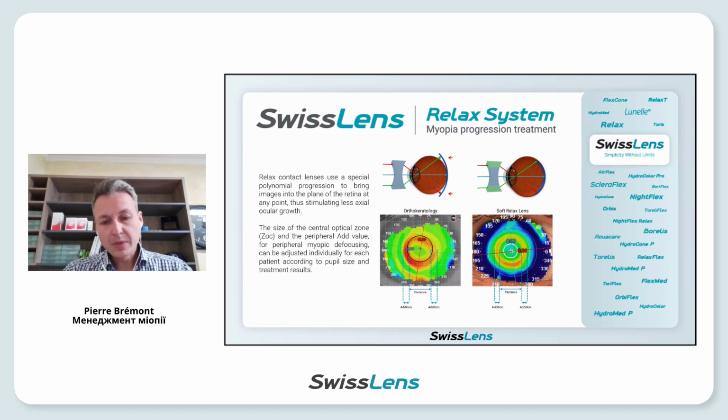So there are two main options, really important in the choice of your Relax lens: the central optical zone diameter and the value of the addition. So how much defocus you need in the periphery to make the retinal image in front of the retina. On the images, you can see the two options and the two results of the options on the topography.